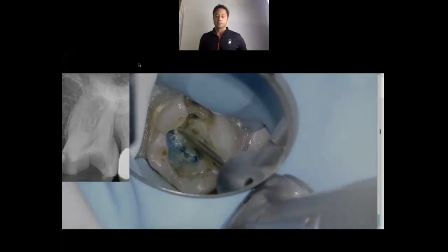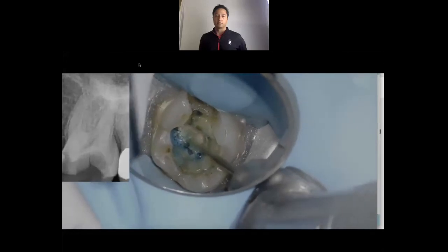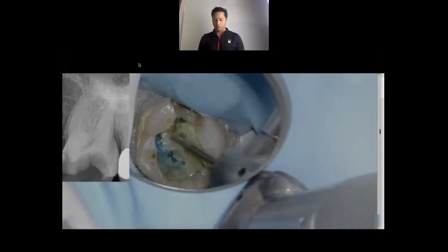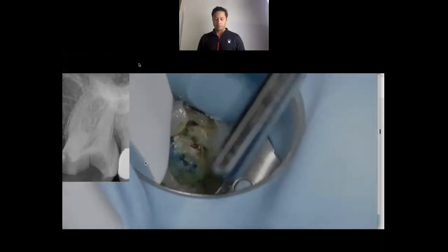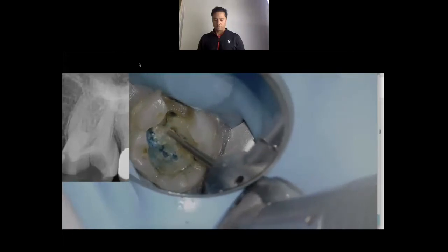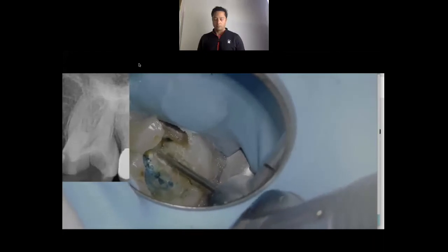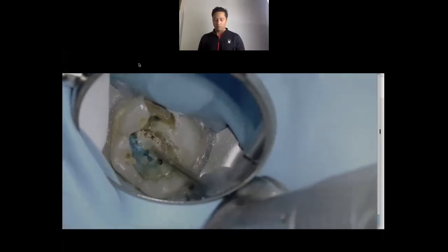My dental assistant is blowing air over this — that gets the dentin debris out of the way so you can keep a nice clean field. And you're going to see me pop into the pulp chamber right there. That tells us our diagnosis was correct — it's still vital and she did respond to cold, so that's to be expected. Next I'm going to keep using my Muntz bur in this situation. We could use an endoz bur, but I wanted to use this to unroof the pulp chamber — I'll do this in some cases like this.